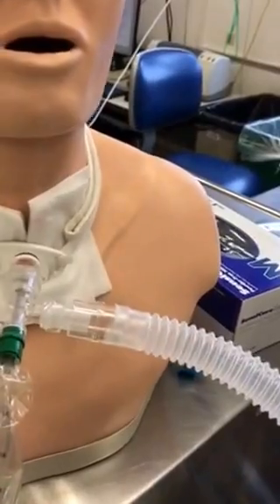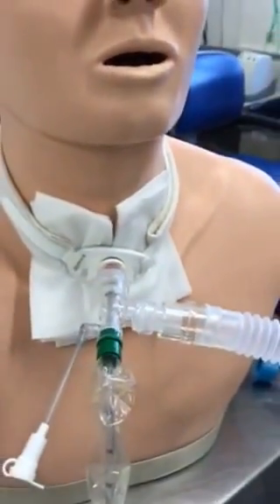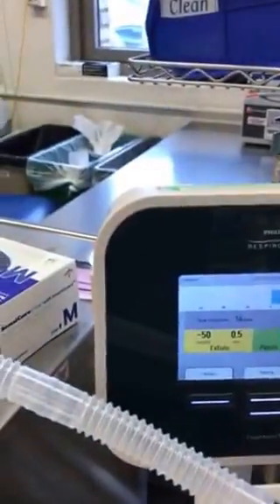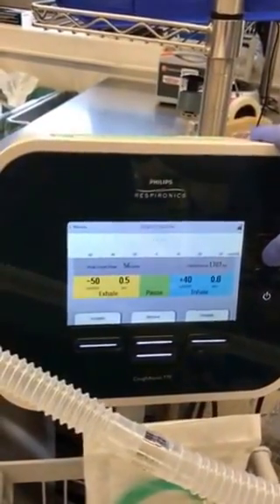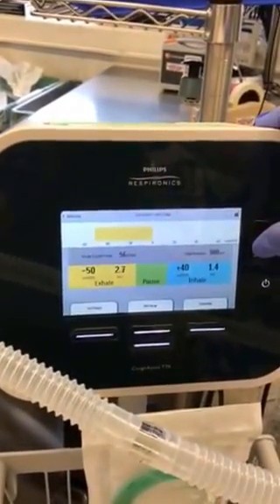You can also combine this with manual cough assist, quad coughing, if it helps them more. But like I said, you do in, 2, 3, out, 2, 3, in, 2, 3, and flip over to cough, and out, 2, 3.